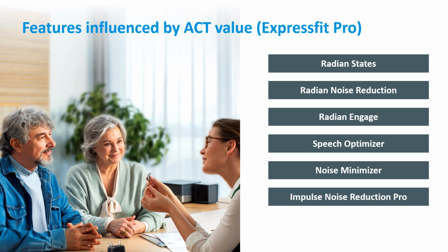One thing which is very important for you to know is that the audiogram and the age of the client, in addition to the ACT value, will also influence these settings. That means that even if the ACT score is the same, but the audiogram or the age is different, then it will not give the exact same changes in these settings.